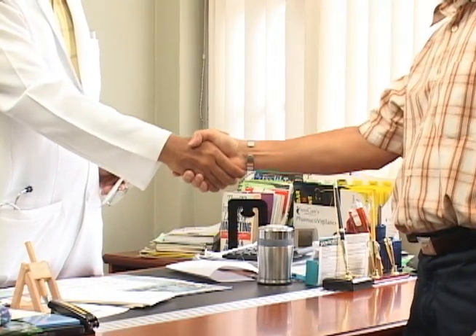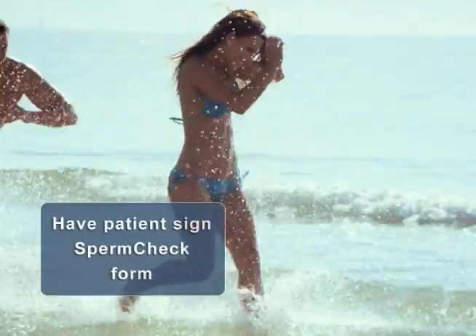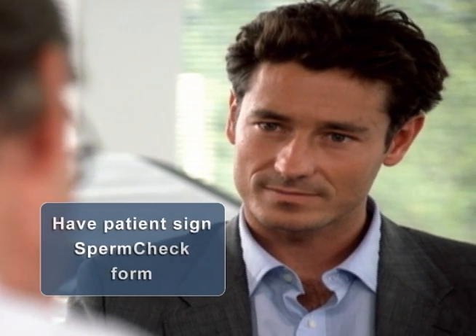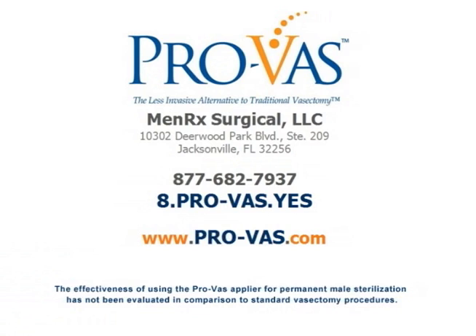A ProVas occlusion procedure requires no special postoperative measures or precautions beyond those that would normally apply to a standard vasectomy. After the patient's semen analysis, be sure to report the results along with any significant clinical events or other relevant feedback to Menrec Surgical for inclusion in our clinical registry. If you have any questions, please contact your ProVas representative prior to performing a procedure, and refer to other educational materials available from Menrec Surgical, including the instructions for use that accompany the product.